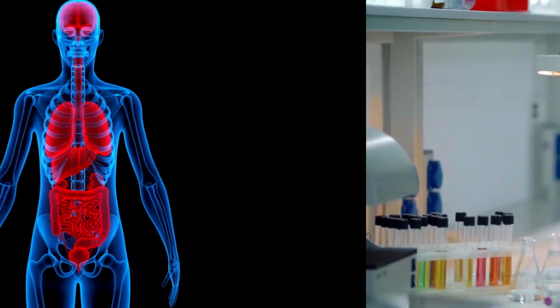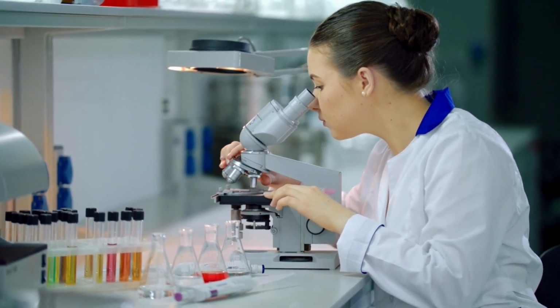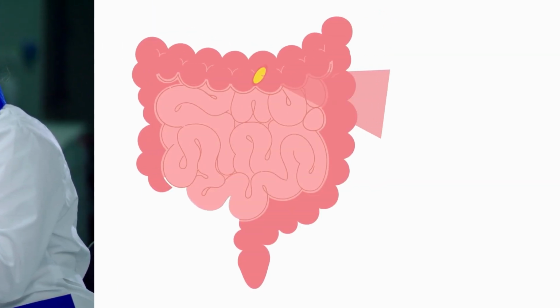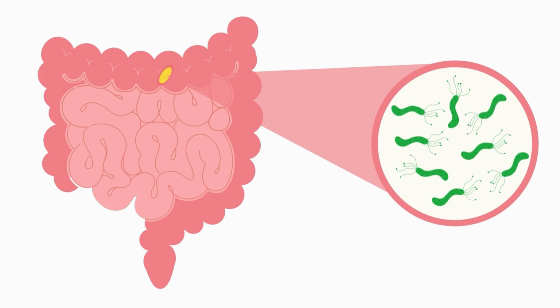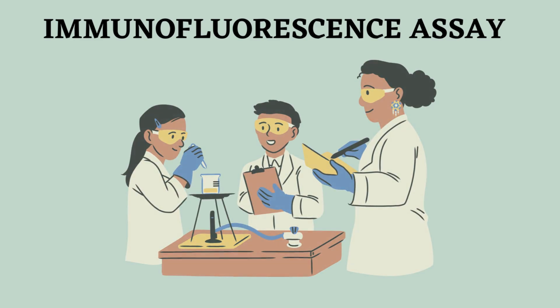In addition to disease diagnosis, immunohistochemistry can be purposed for tissue identification as well. This can be towards research and laboratory methods, or for more clinical applications such as detecting infections in living organisms. Using immunohistochemical procedures, infectious agents can be identified within tissues through using immunofluorescence assay.